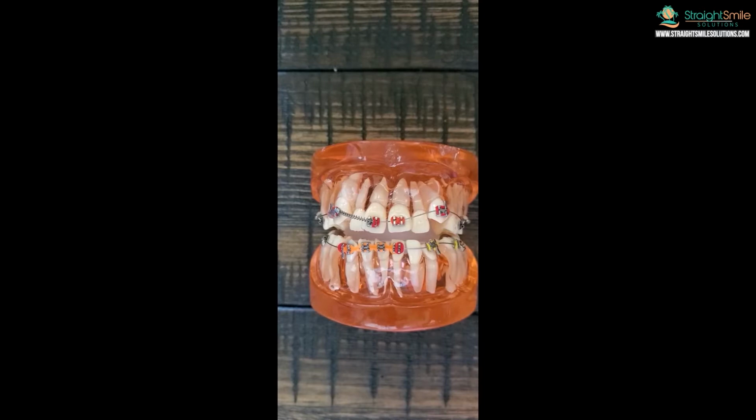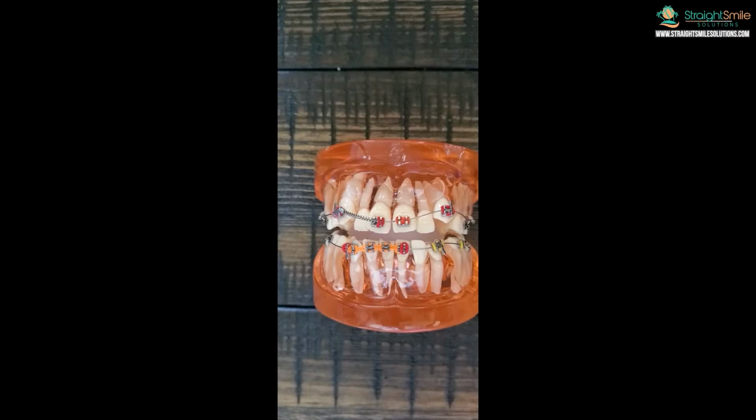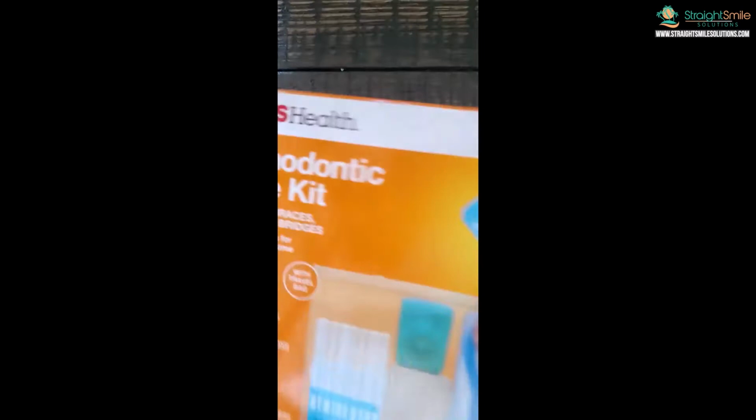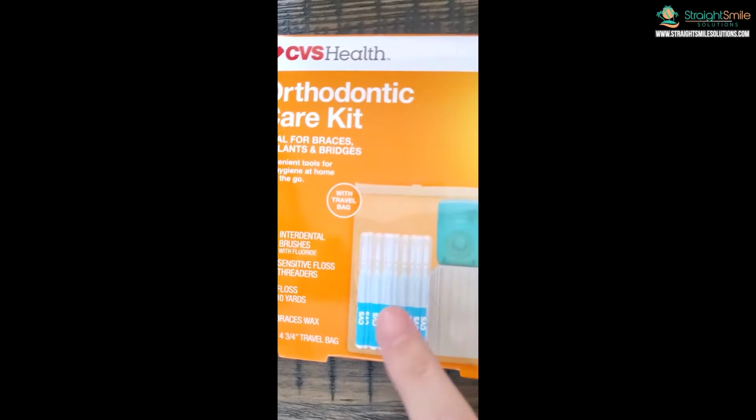So my suggestion is to make sure you have the following things ready to go before you even have your ortho braces installed. I would just have the stuff at home ready to go. They're probably going to give you a take-home goodie bag kit, but you need more than just a little bit. So might as well go buy it ahead of time, and I'll show you what you need. Hang on. This is a kit that I got at CVS. You can see it right there. But you can buy these anywhere. It just has the basic stuff. It has proxy brushes. It has wax. It has some floss, and it has floss threaders.